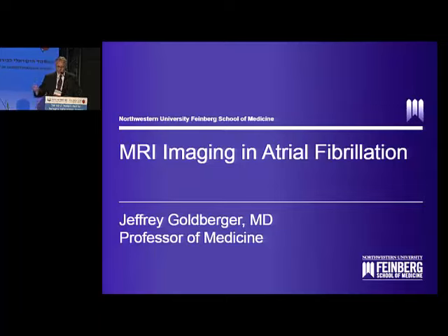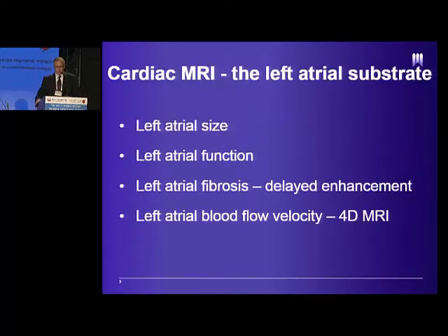And when we talk about personalizing treatment for atrial fibrillation, we have to think about where the disease is. And disease in atrial fibrillation is, of course, in the atrium. Of the whole diagnostic evaluation, the only piece that even has a little bit of a focus on the atrium is the echocardiogram, where we can look at the left atrial size. And I can tell you that very few people today use anything about the left atrial size in the management of patients with atrial fibrillation. So I think ultimately, if we want to better personalize treatment for atrial fibrillation, we're going to have to evaluate the left atrial substrate.